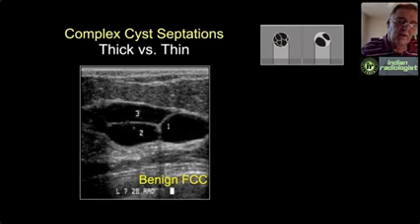These are thin hyperechoic septations. They aren't suspicious. Those are BI-RADS 2. This is benign fibrocystic change. And what are we actually seeing here? We're seeing a thin, approximately 1 millimeter thick or 500 micron thick ultrasound tomographic slice through a single cystically dilated TDLU.